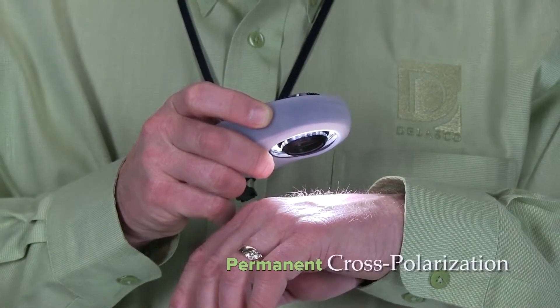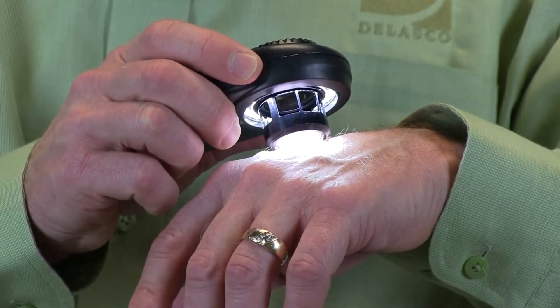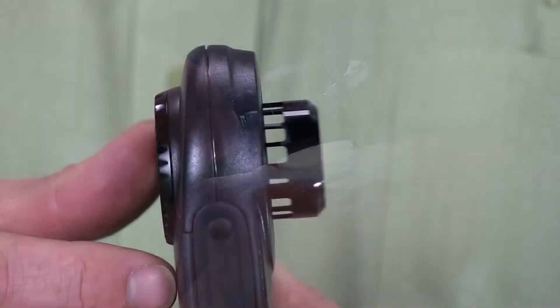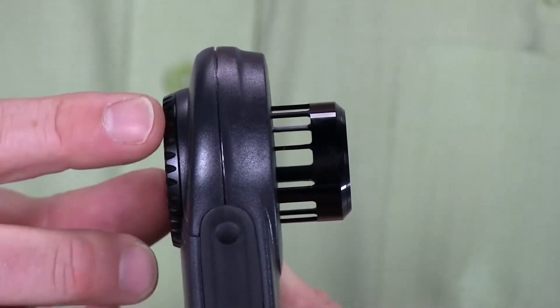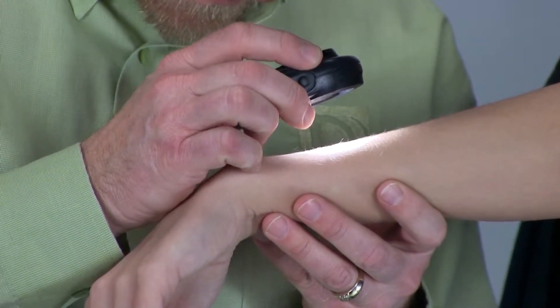This unit is in a permanent cross-polarization mode, and a simple push of a button switches between 16 or 32 LEDs for light intensity adjustment. The retractable spacer makes for another first in skin imaging — you now have a choice between contact and non-contact dermoscopy.